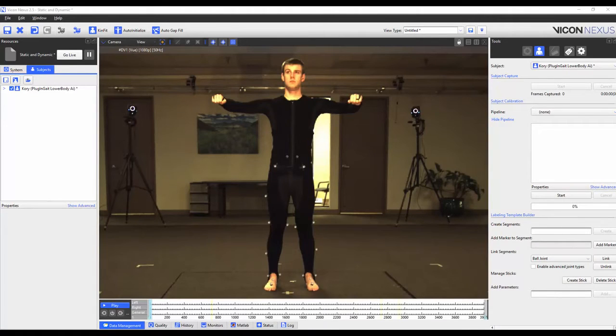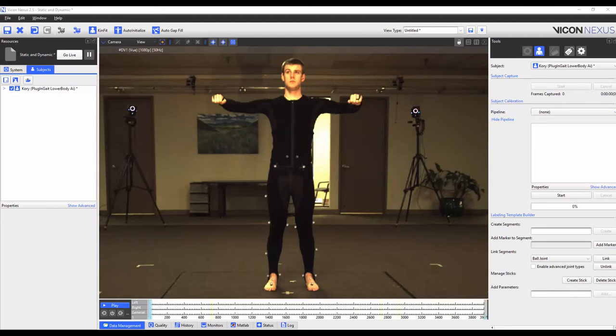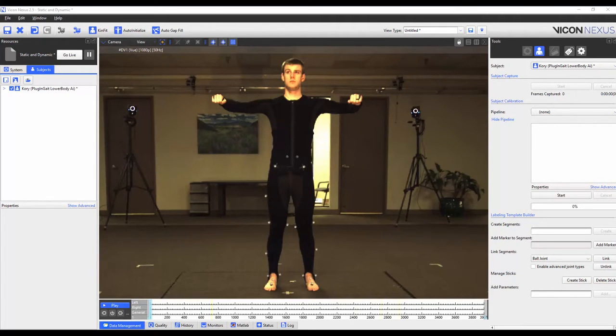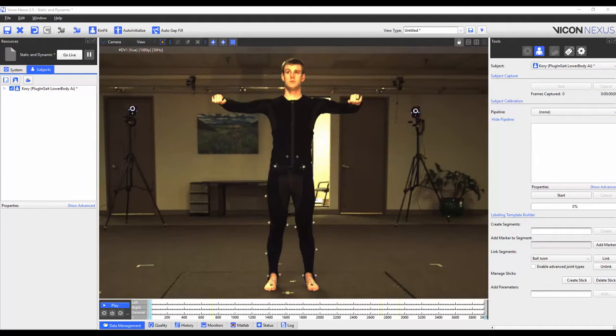To add the extra markers I have placed all the existing plug-and-gate lower body model markers onto my subject. I have then added four extra markers onto the medial knee and ankle joints.